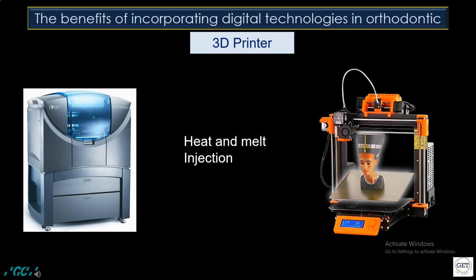When different resin materials needed to be used, the change of the resin required a complex procedure of cleaning the system and waste of resin material. In the new printers, more than one material can be used. Still, the high cost of these high-quality printers makes them not applicable for all dental offices or clinics.